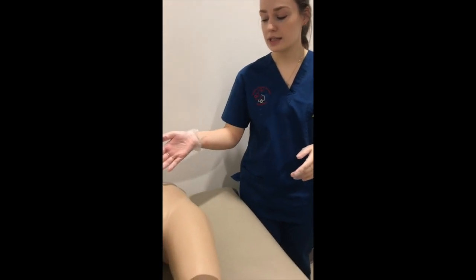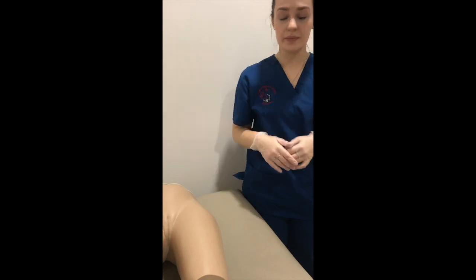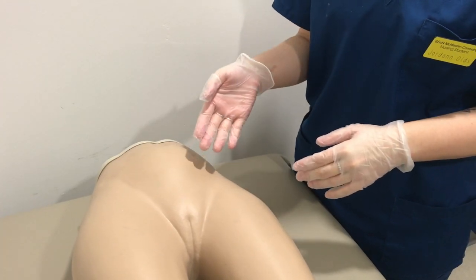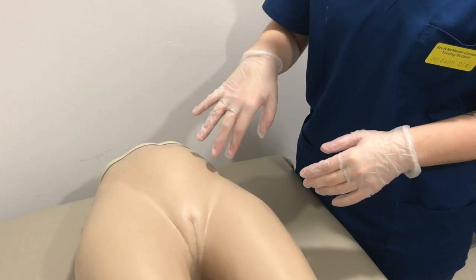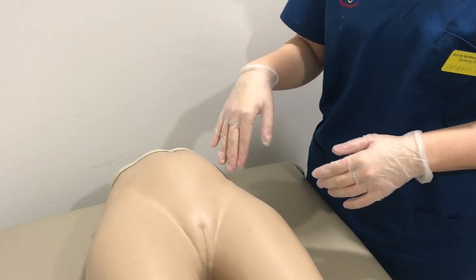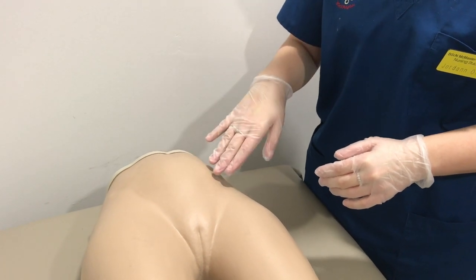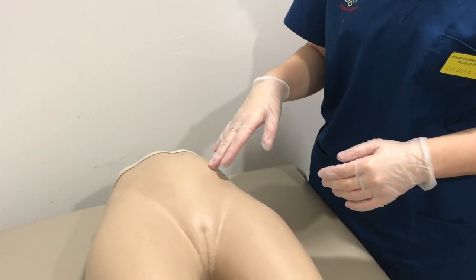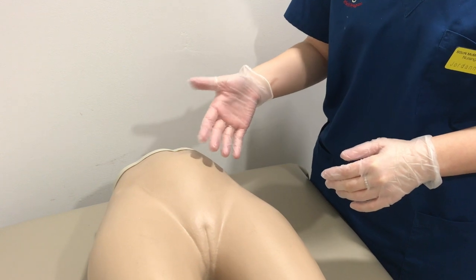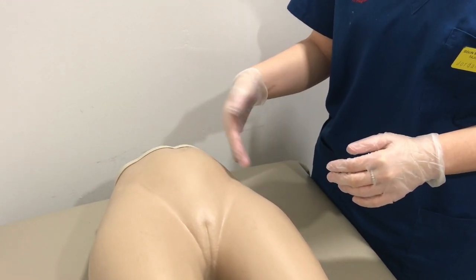The 3 areas for subcutaneous injections are the abdomen, the anterior aspect of the thighs, as well as the back of the arms. Before we do the injection, we're just going to inspect the injection site that we're planning to go to. We're going to make sure there's no bruising or any irritation, inflammation, anything like that. Especially because we will be injecting heparin, it is a blood thinner, so you want to make sure you're not going to be worsening any possible underlying issues if there is bruising already there.